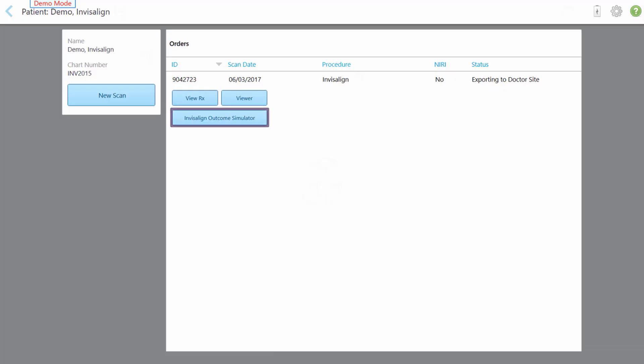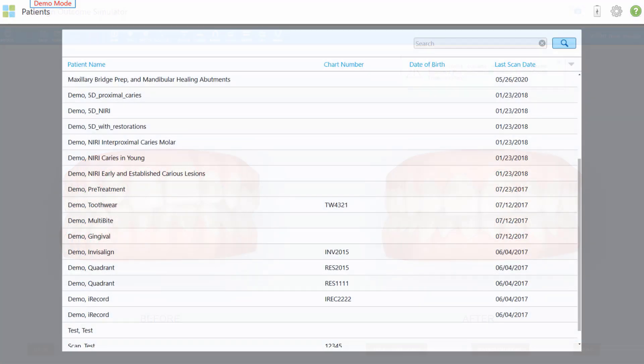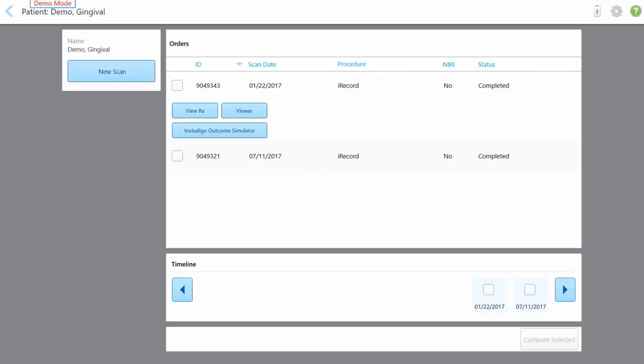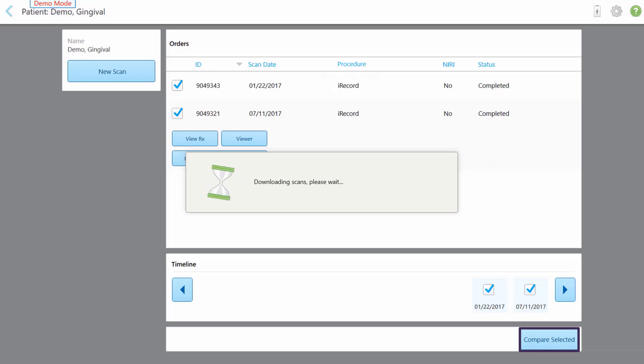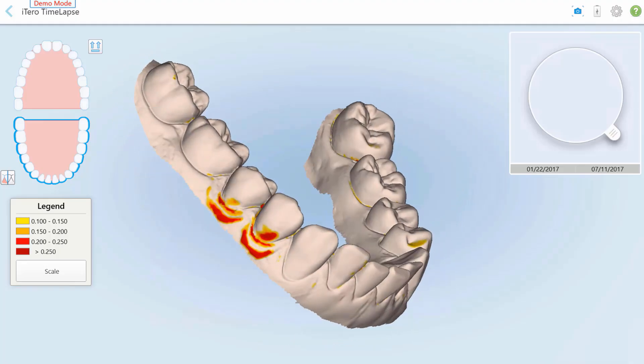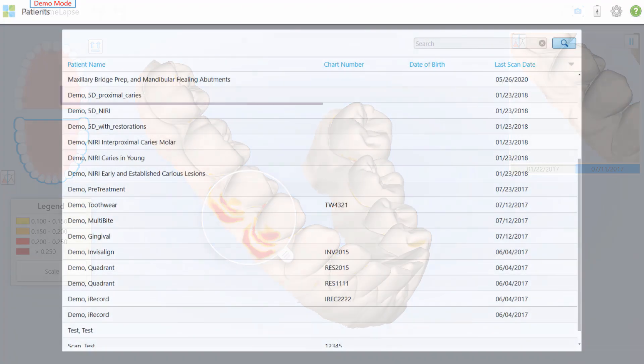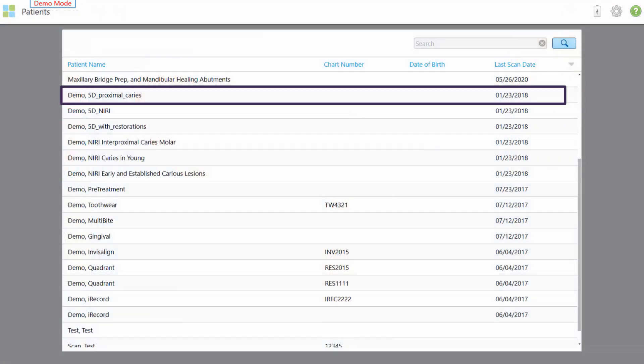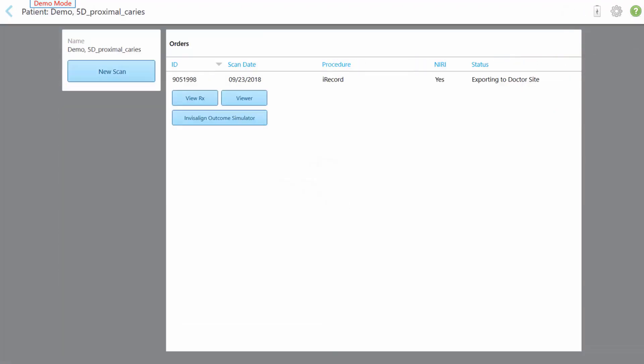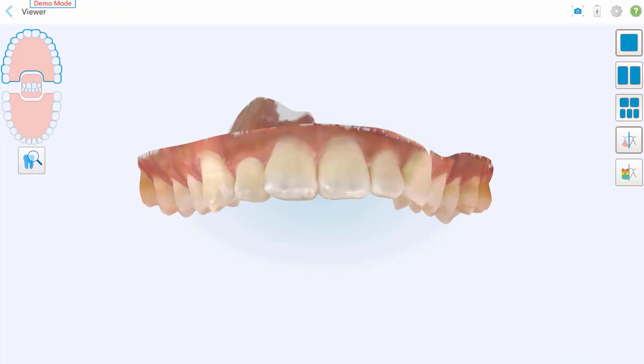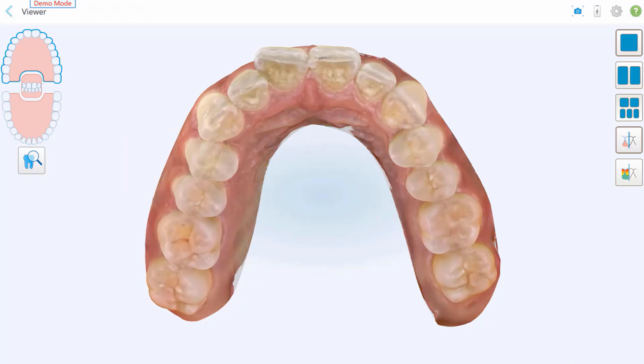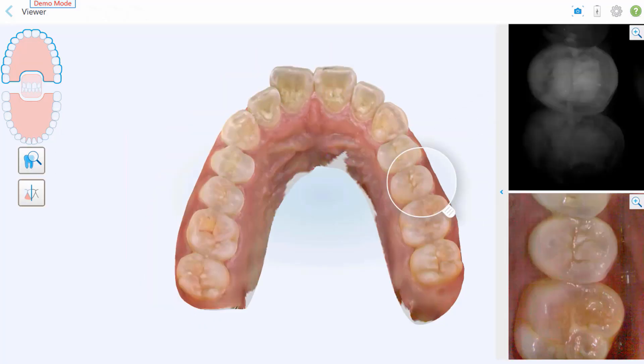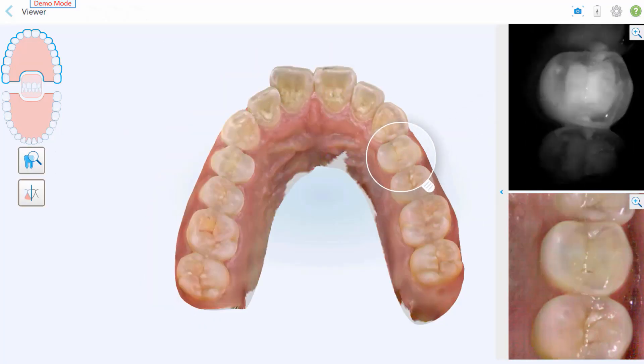For oral health assessment cases, tap demo gingival, for example, to see how iTero time-lapse technology indicates the scope of gingival recession over time. The iTero Element 5D and 5D Plus imaging systems include sample cases that demonstrate the use of the intraoral camera and iTero NIRI technology, such as demo 5D proximal caries.